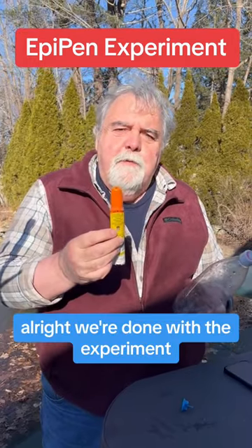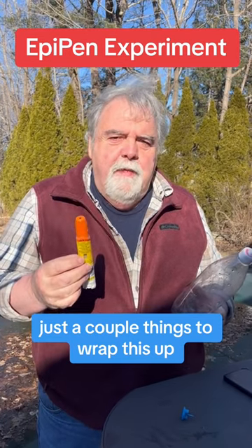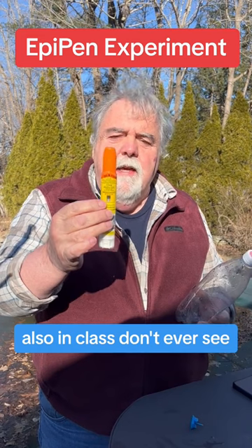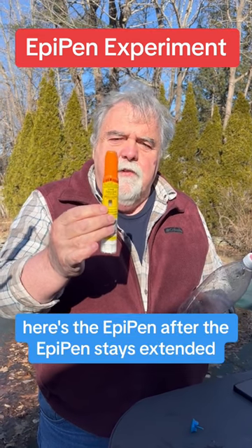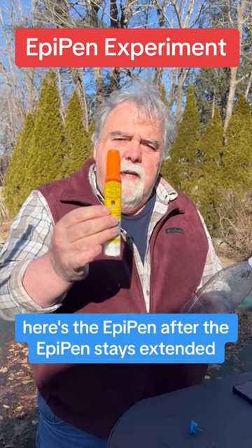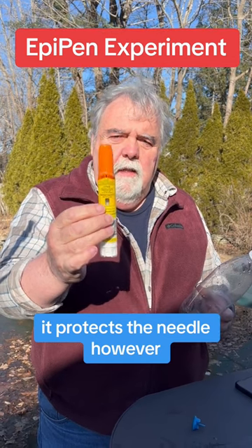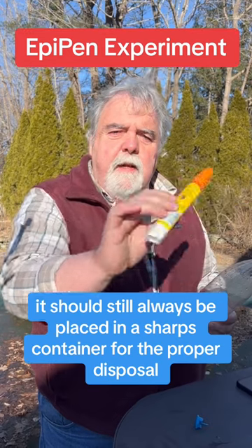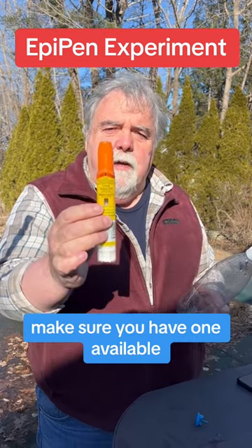We're done with the experiment — just a couple things to wrap this up. That was pretty cool to watch. Also, something you don't ever see in class: here's the EpiPen after use. The EpiPen stays extended — it protects the needle. However, it should still always be placed in a sharps container for proper disposal. Make sure you have one available.